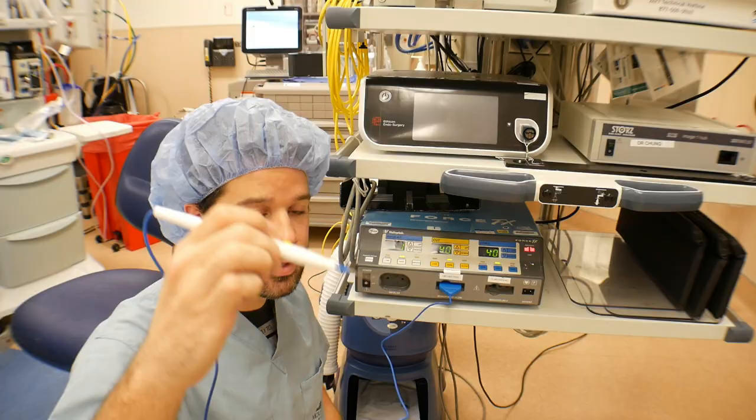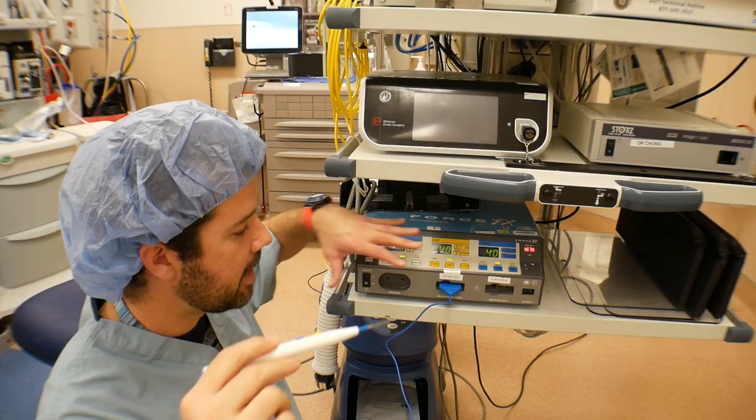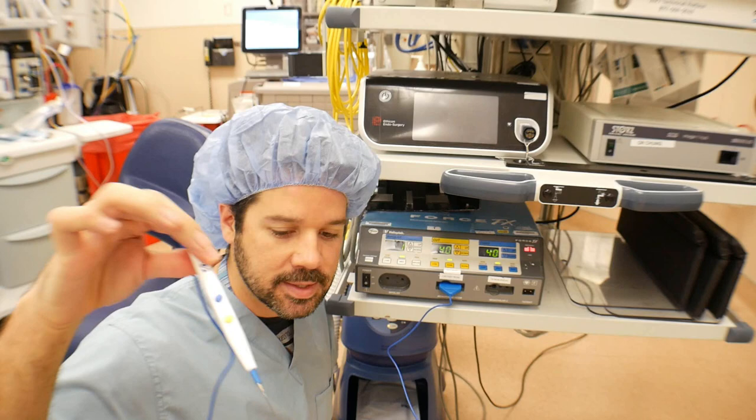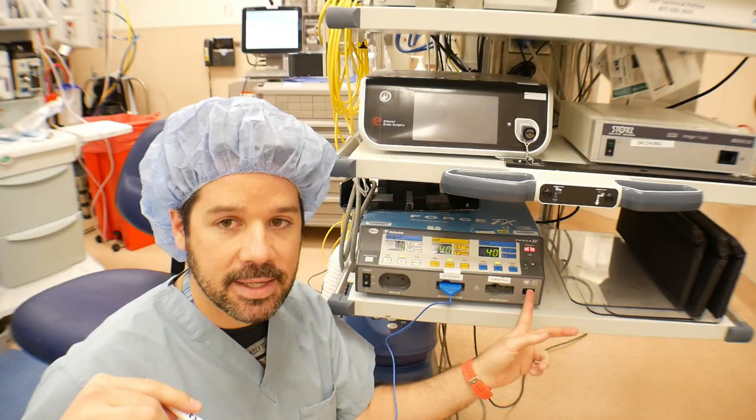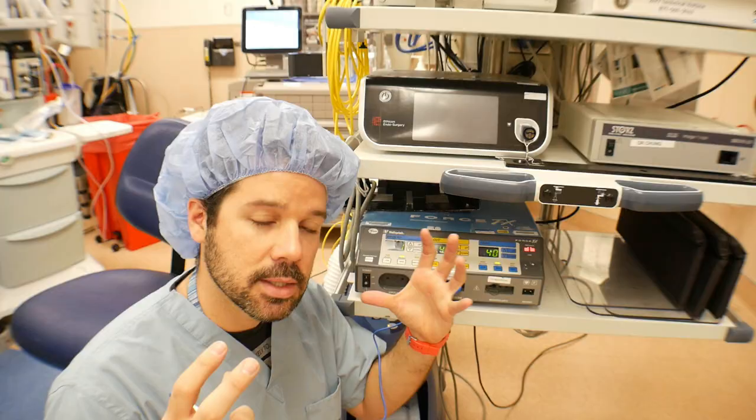As you activate the electrode using one of the buttons on the BOVI machine, the power will come from the generator down the wire all the way to the tissue of the patient. It will go through the tissue down to the dispersive pad or ground pad, and back through the wire of the ground pad to the generator itself. That is the electrosurgical unit circuit.